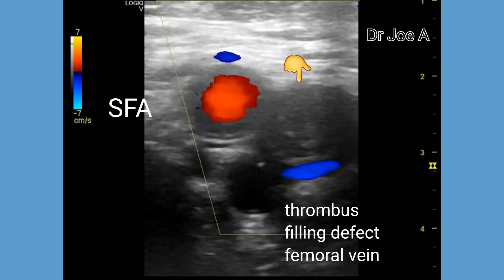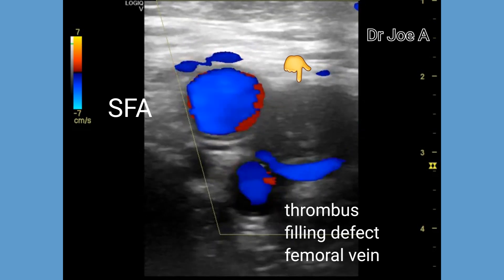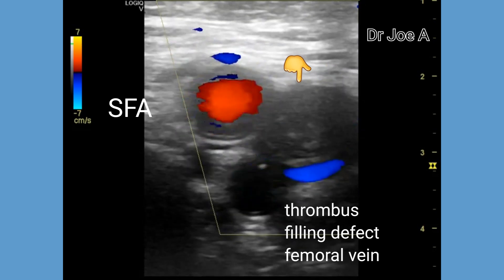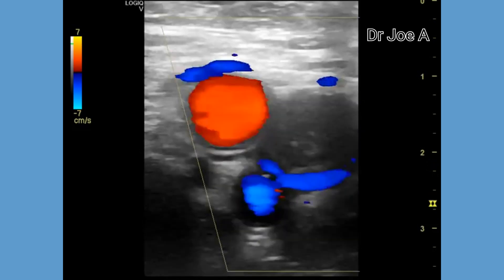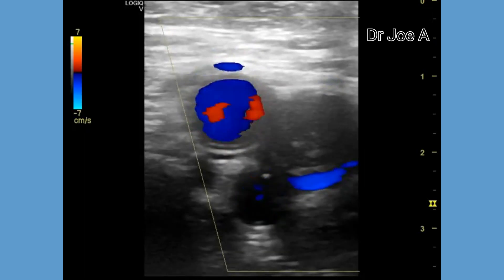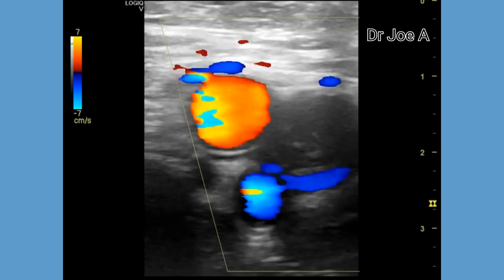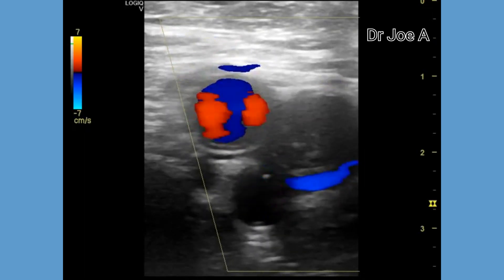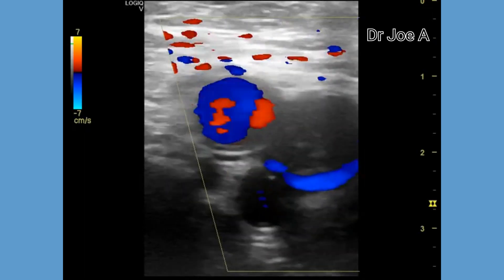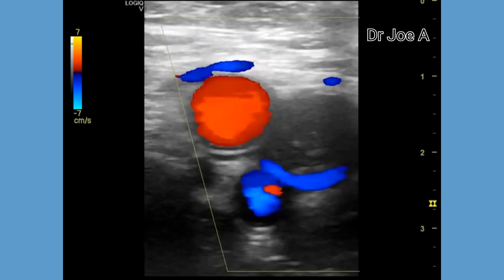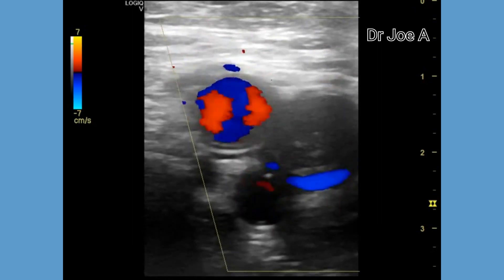In addition, there may be calcifications within the thrombus. All these features are not seen in this case, hence it appears to be a subacute thrombosis of the right femoral vein.